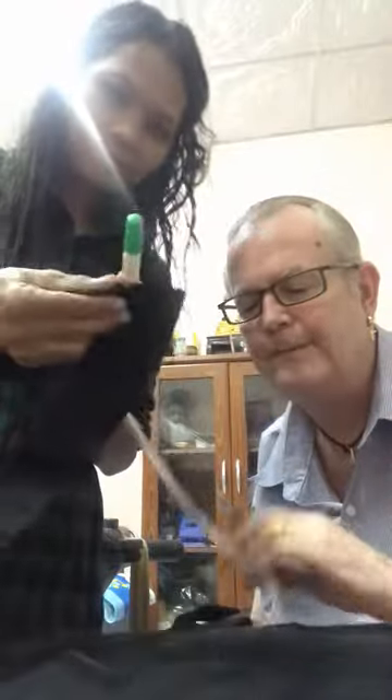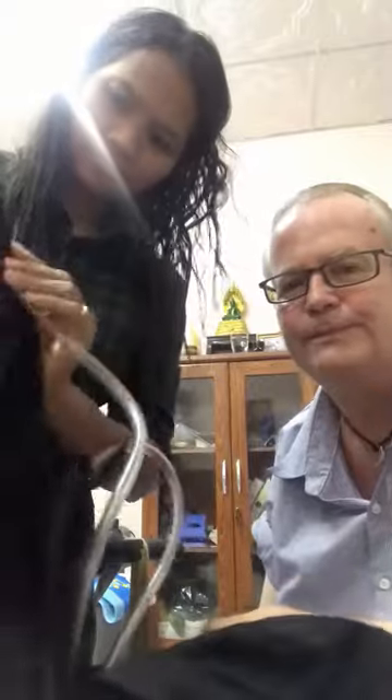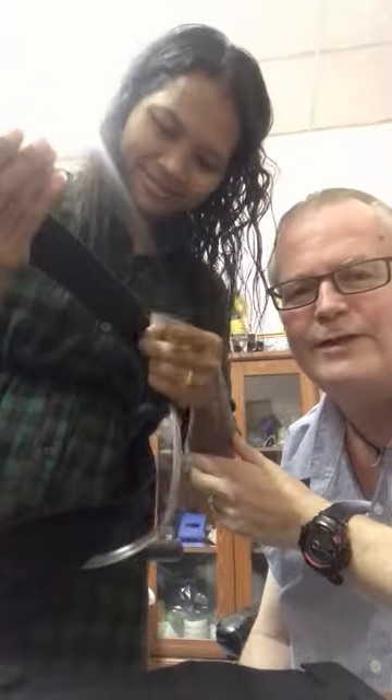So now May is going to put the pipe cover around the catheter bag pipe like so. There you go — just so that everybody can see.